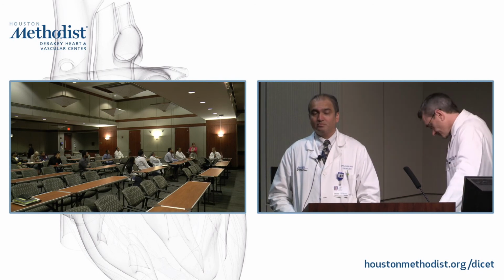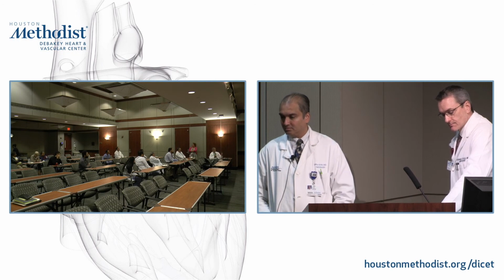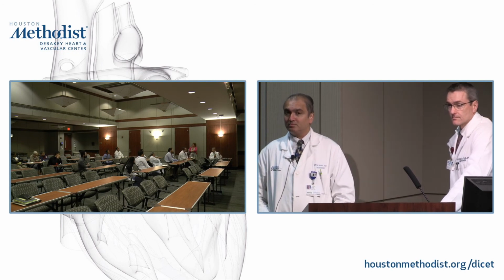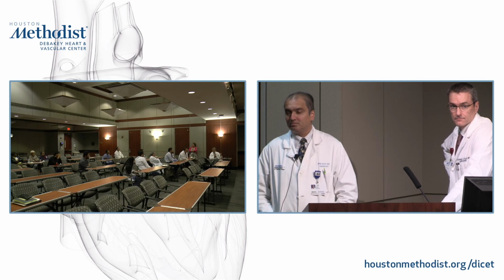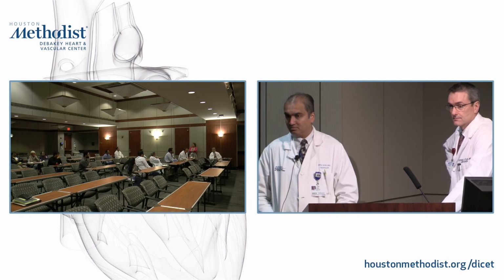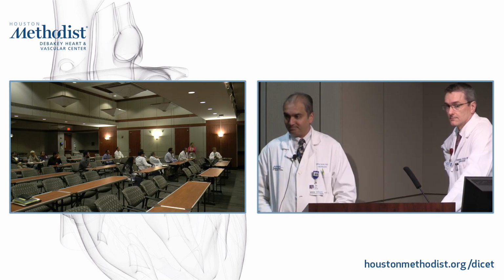If you know the mechanism, if I know it's prolapse, if I know it's a small flail, or I have multiple jets, doing a transesophageal is not going to help you quantitate better. So if you want quantitation of regurgitant volume because of all the issues of color Doppler, I think CMR would be better. All right, thank you.